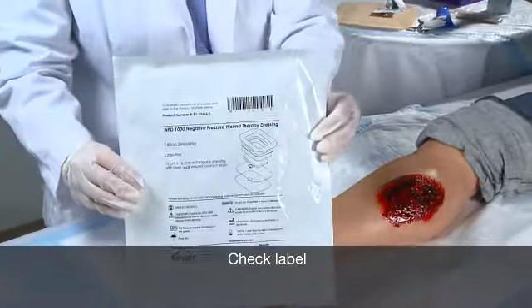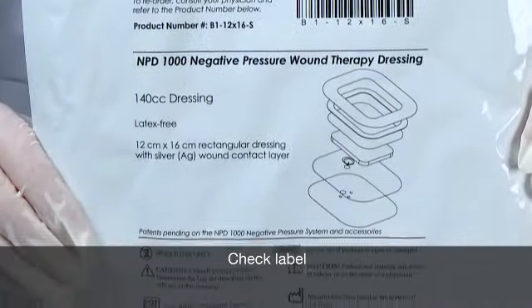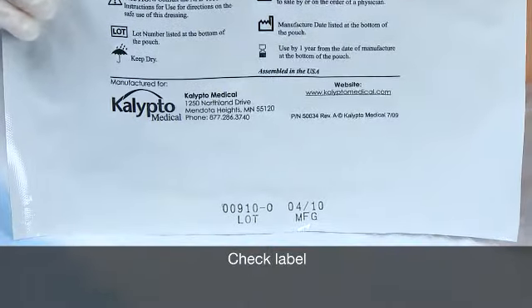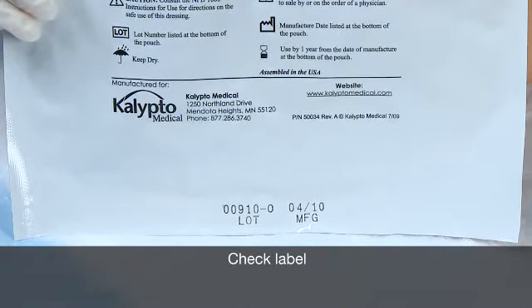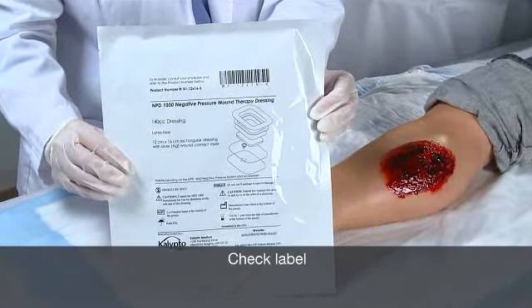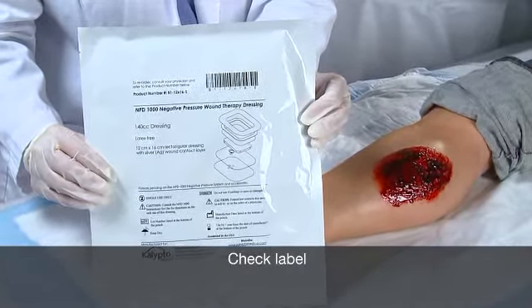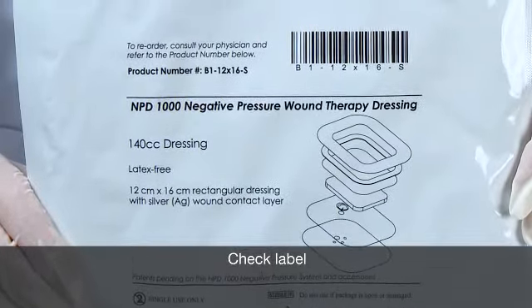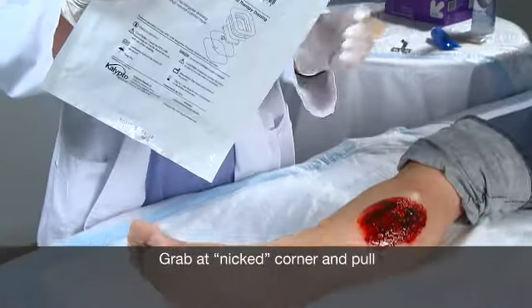Before opening the wound kit, check the label to ensure you have the correct product and it is not expired. Expiration is one year after the manufacturing date on the package. Wound kits should be chosen based on wound size, location, and amount of drainage. The wound kit size and absorbency are labeled on each package.